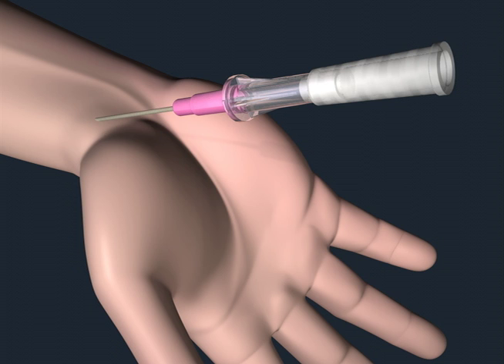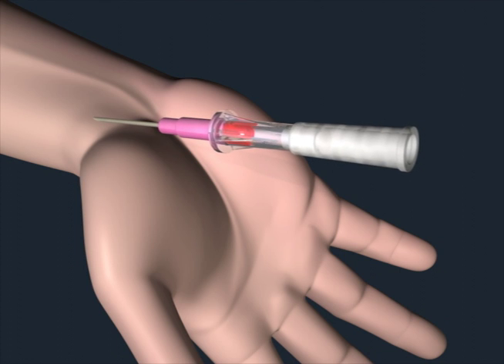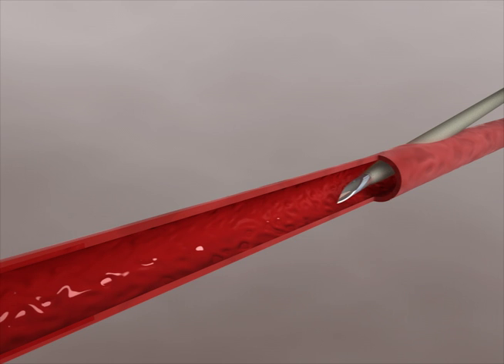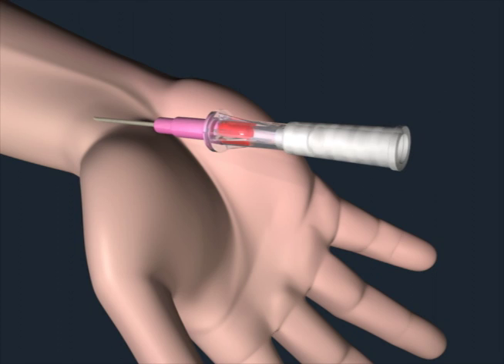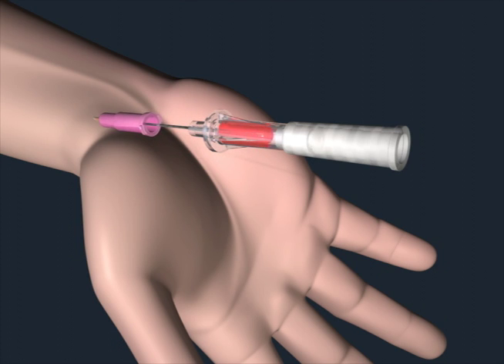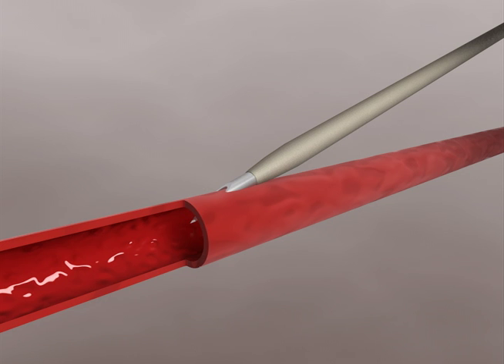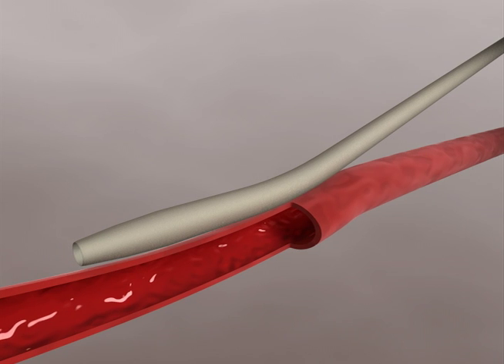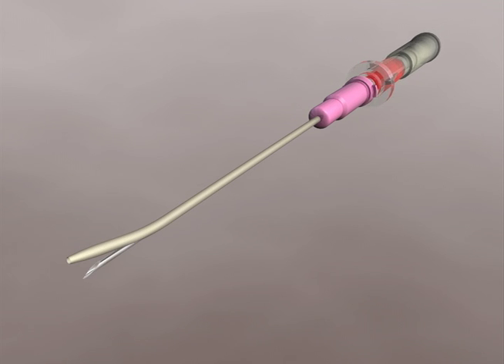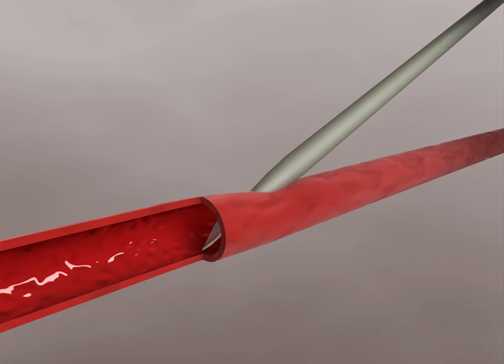Here, the angiocath is advanced toward the radial artery. When a flash of arterial blood occurs, the angle is flattened and the entire device is advanced a few millimeters further. When the catheter is threaded off, a sleeve of blood forms between the catheter and needle, signifying that the catheter tip is in the arterial lumen. Blood flow into the flash chamber continues as the catheter is advanced off the needle. Often a flash occurs when only the needle tip has entered the artery. If the catheter is advanced at this point, it will push the artery off the needle and the attempt will need to be aborted. If one tries to reinsert the needle in an effort to reestablish flow, the needle can puncture the catheter wall or even shear its tip off. Hence, we see the importance of advancing the entire angiocath after the initial flash.